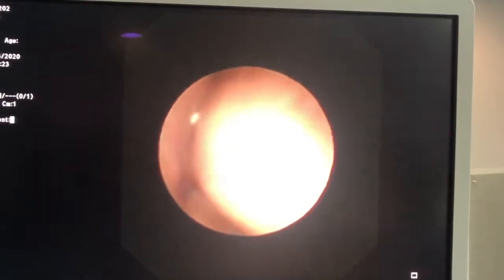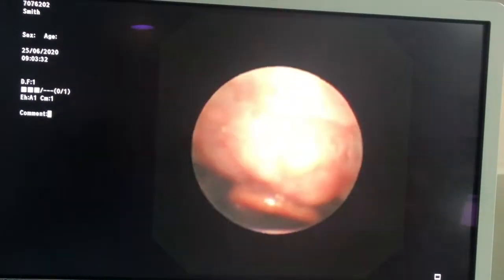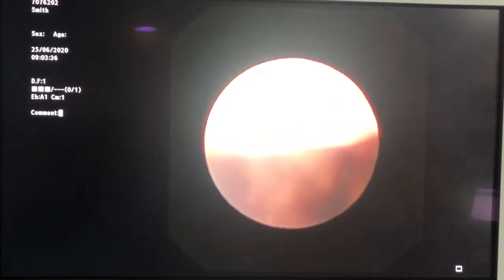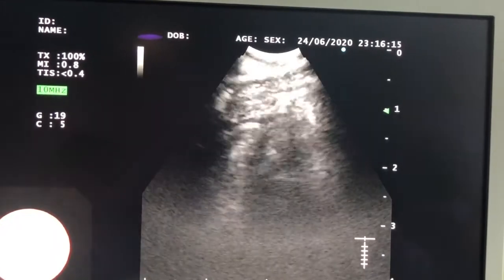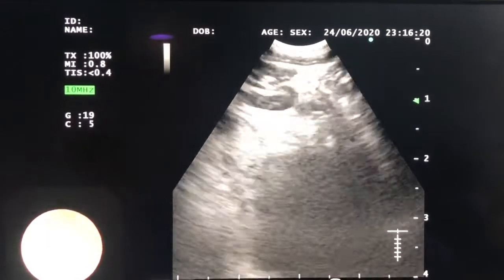Here's the endoscopic procedure. The linear eBus scope is going through the mouth guard and slides over the back of the tongue as per usual. There's the uvula, we'll see the epiglottis, and we'll go down past the epiglottis and see the vocal cords. Instead of going through the vocal cords as per usual, we'll go posteriorly and find the esophagus. Once in the esophagus the scope slides in quite easily, but we lose visual landmarks so we use ultrasound to find landmarks.